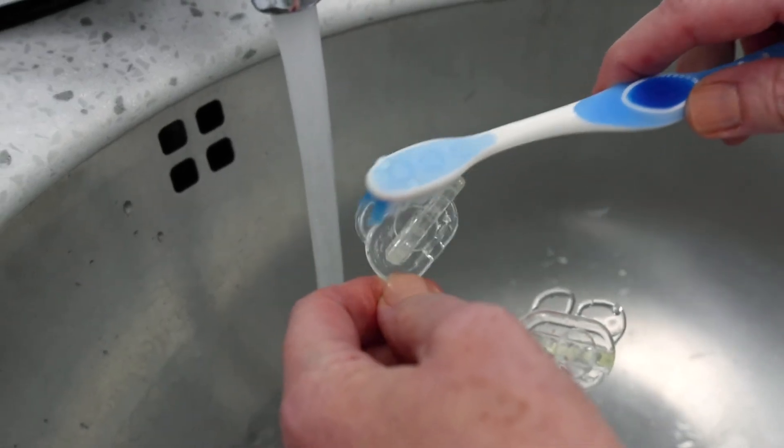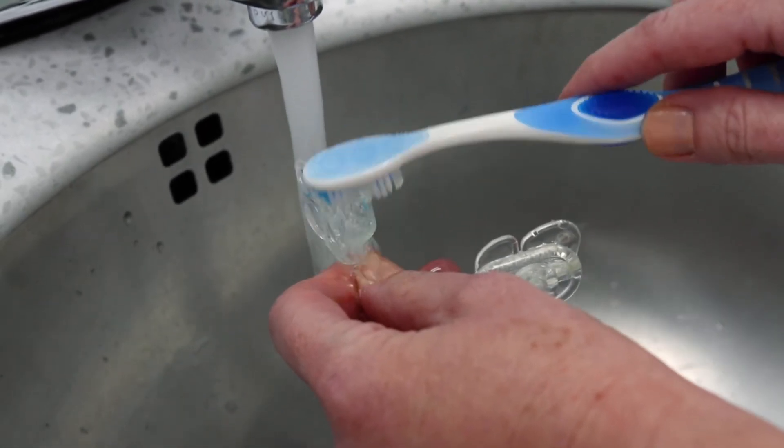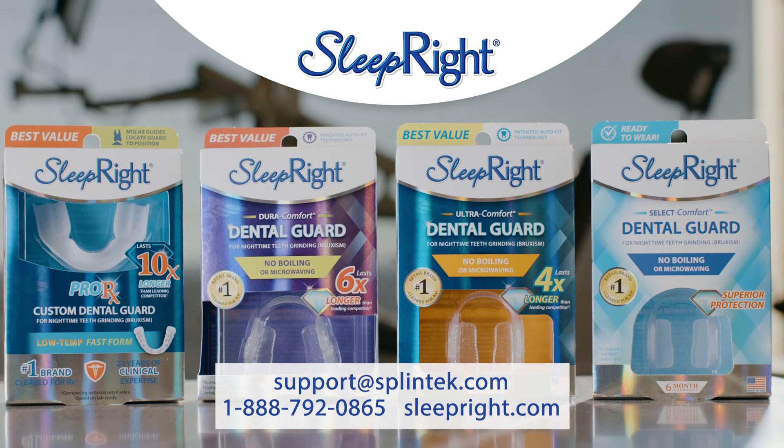To clean your dental guard, rinse it with cool water or mouthwash, or brush it with a toothbrush and toothpaste. Avoid hot water. Dry it thoroughly and store in the case. Protect your smile with the Sleep Right DuraComfort Dental Guard.